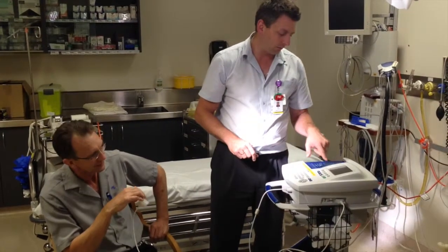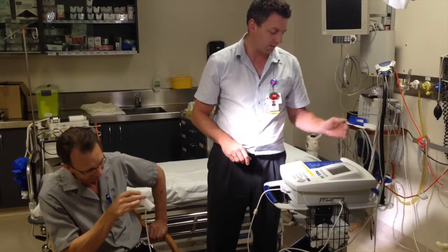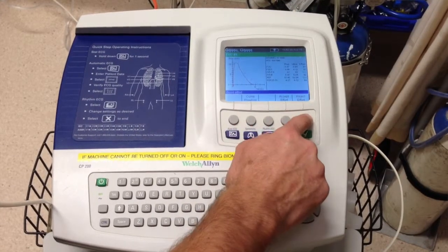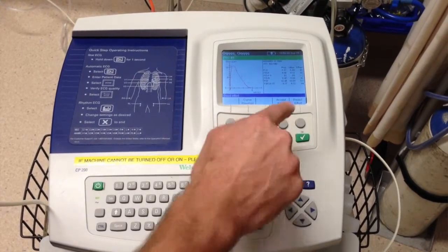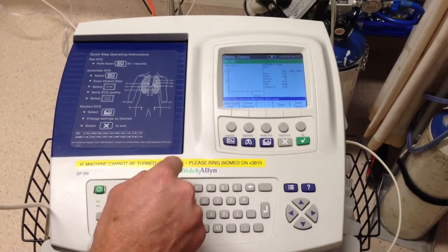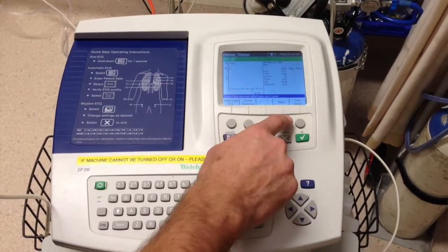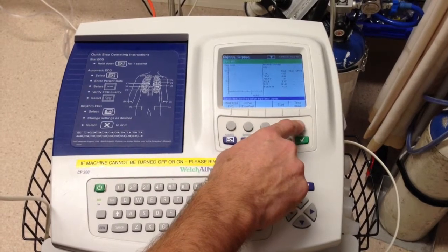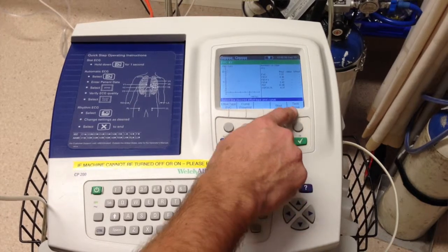That was good. We review our results and we can either accept or reject it. If it doesn't look like they've reached their targets we can reject it and do it again. But if he has achieved it, we press accept the effort. We can either say the test is done and it'll print out a form, or if we want to do a post effort we can do that as well.